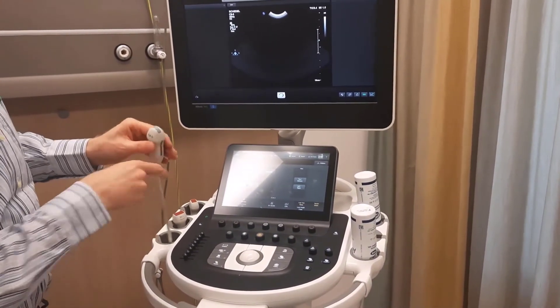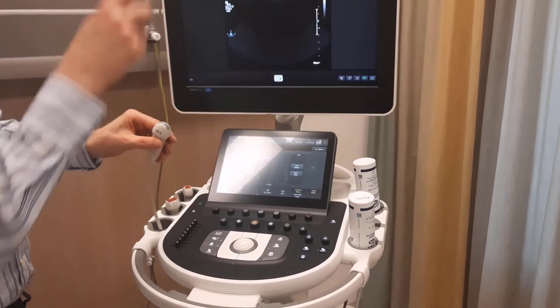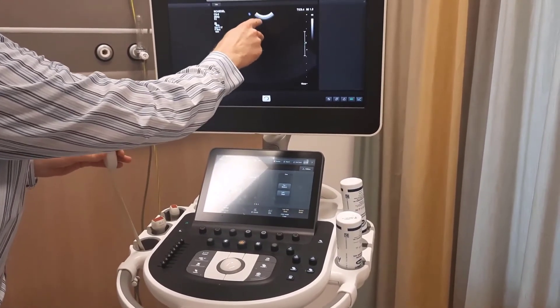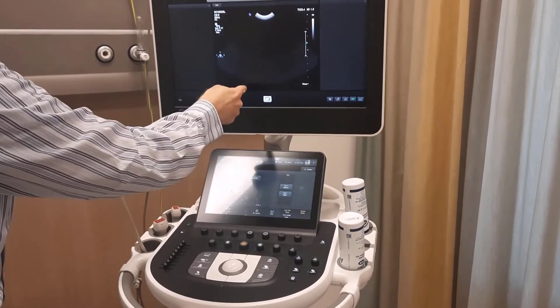This transducer has a number of crystals. Each crystal transmits and receives. If one of the crystals is failing, then you see a black line.